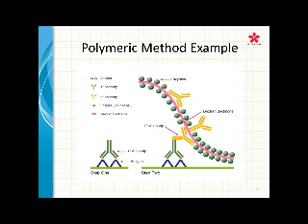So again, you're going to deparaffinize your slides, and you're going to do epitope retrieval by heat-induced, enzyme-induced, or heat and enzyme-induced epitope retrieval. And then you're going to apply your primary antibody, which is whatever antibody you're trying to detect, CD3, CD4, CD5. Your secondary antibody and your enzyme at this point are going to be combined.